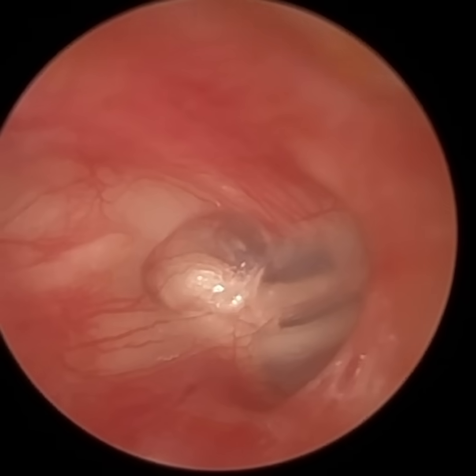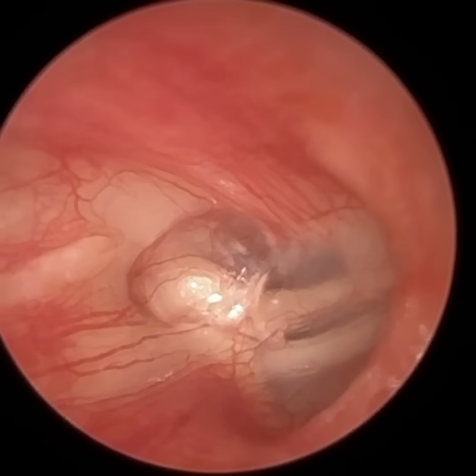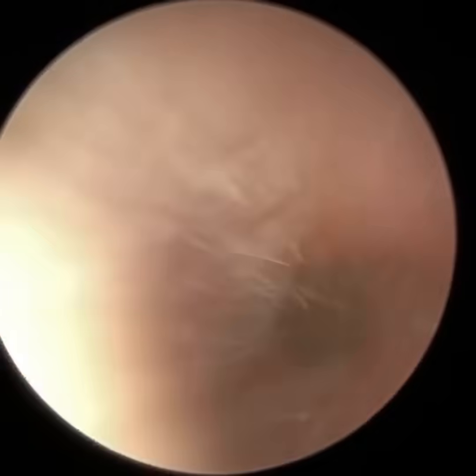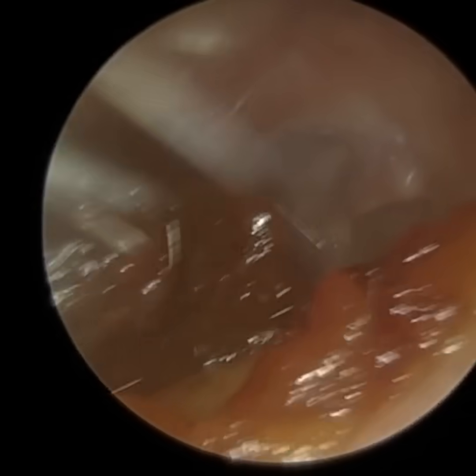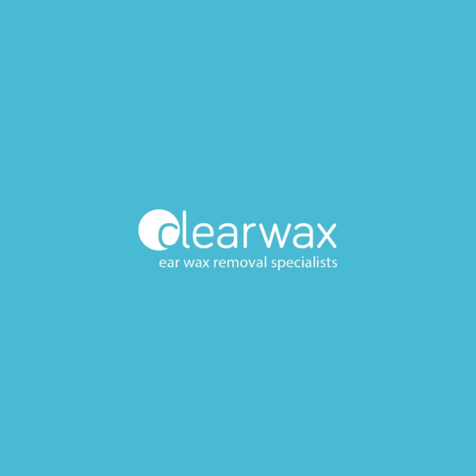That's the patient's eardrum. You can see it's a second narrowing there. It's an abnormal looking eardrum. They've got an autoatticotomy, so the top part of the ear canal, the scutum bone, is eroded, and you can see the neck of the malleus and the head of the malleus as well. So I'm just going to explain the tuning forks.